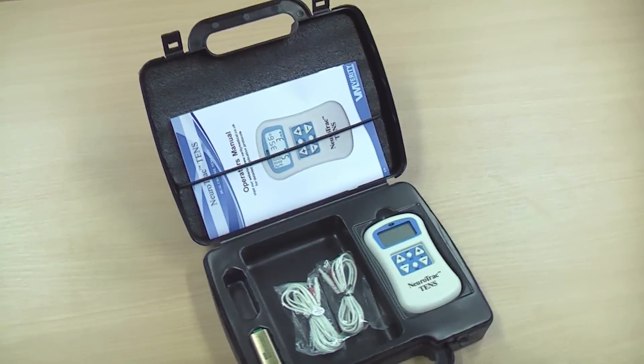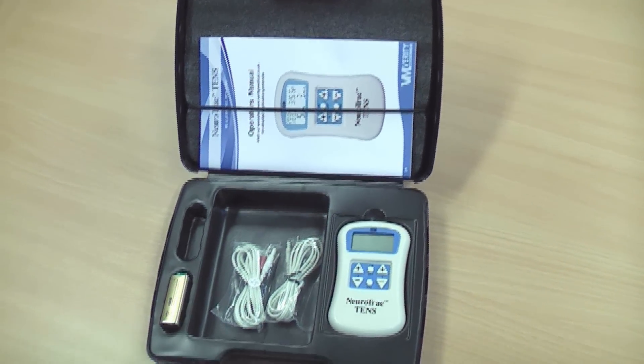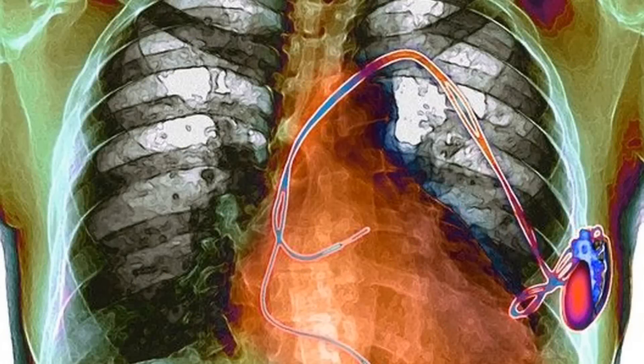We strongly advise talking to your GP or physiotherapist before using TENS, as they may know of a reason why it might not be for you. For example, TENS must never be used if you have a pacemaker.